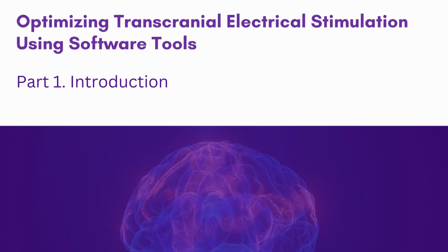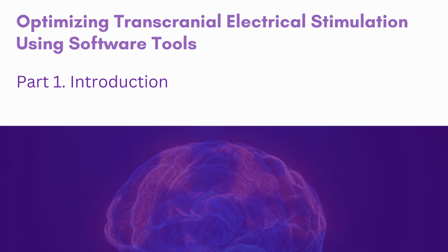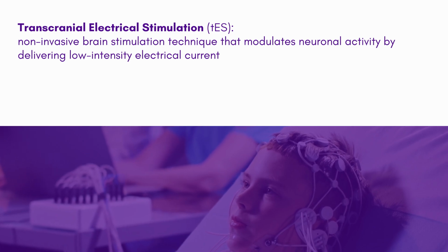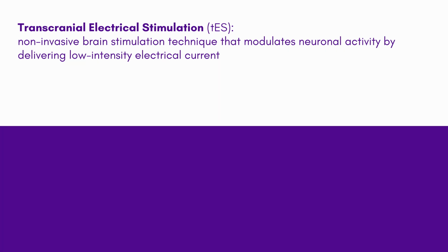Welcome to the video tutorial on optimizing transcranial electrical stimulation using software tools. TES is a non-invasive brain stimulation technique that modulates neuronal activity by delivering low-intensity electrical currents through electrodes placed on the scalp. Optimizing the parameters of these electrodes is crucial for maximizing the effectiveness and safety of the treatment.